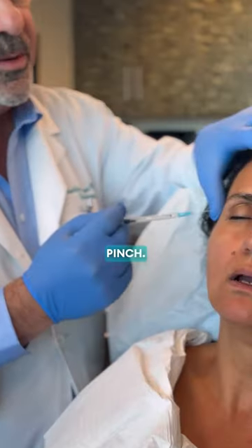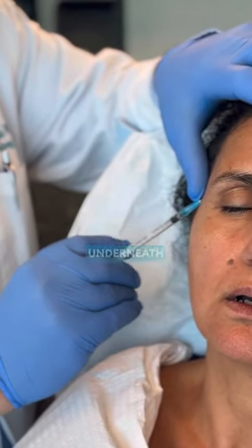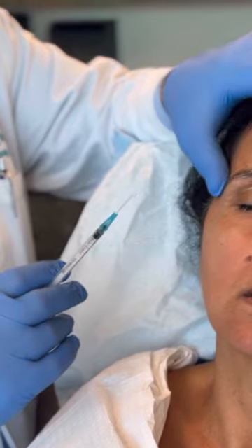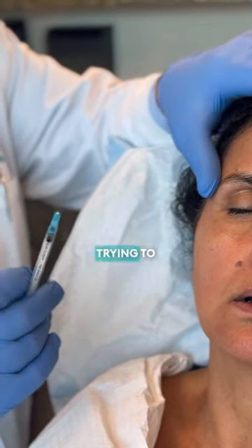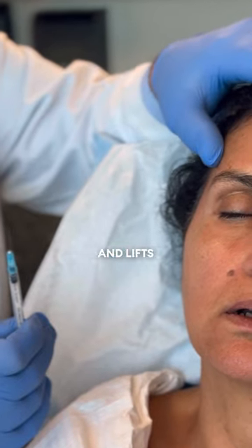We're going to go ahead and start — little pinch. We're looking for the temporal area. This is one of the areas where right away we lose fat, underneath the temporal muscle, and it gets these hollows in the side of the face. We're trying to rebuild that because if you fill that up it also lifts the eye and lifts the brow up a little bit.